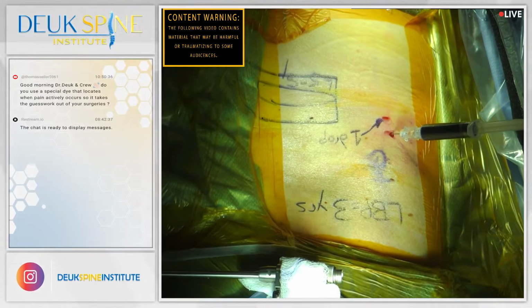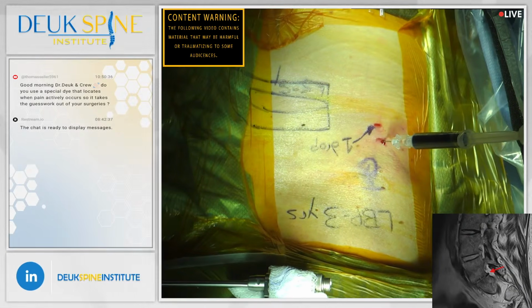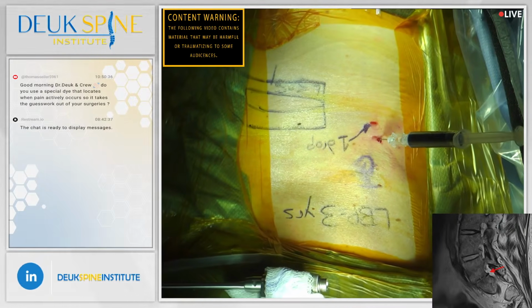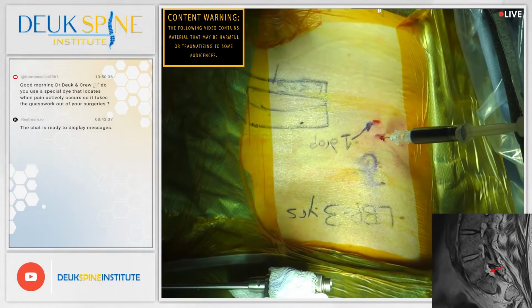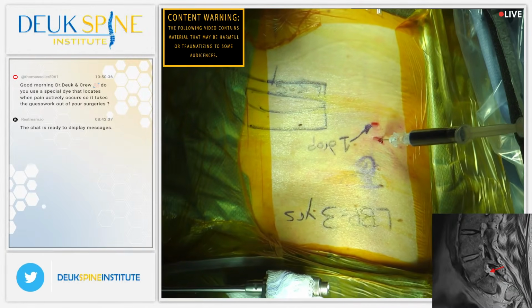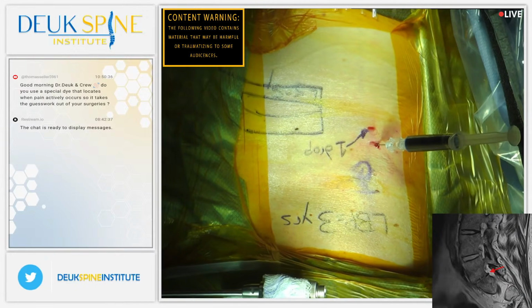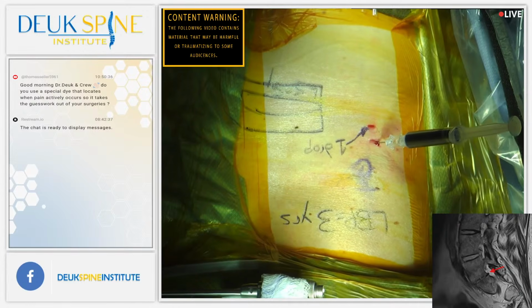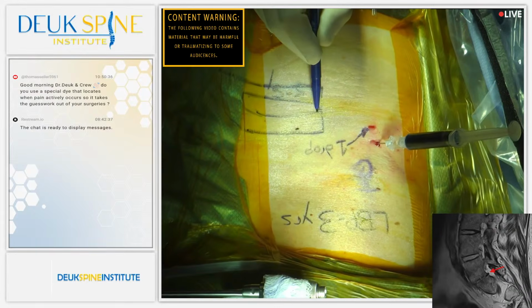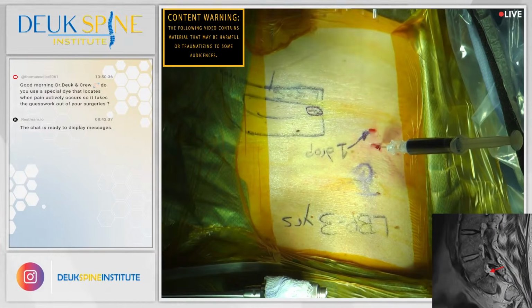Okay, welcome back to our live stream on December 4th, 2025 from Deuk Spine Institute. And again, I'm Dr. Deuk Machen, CEO and founder, here with my team, including Luis, Dr. Berndes. Our patient is asleep on his belly, and we are now inside the disc at L5-S1. Specifically, we're here to fix a very small tear in the back of that disc. That tear is honestly the size of a pea.